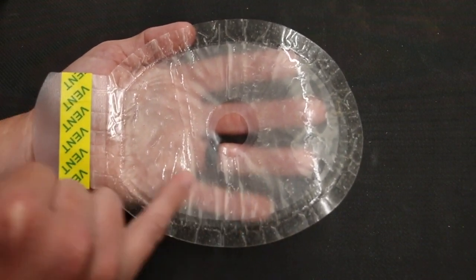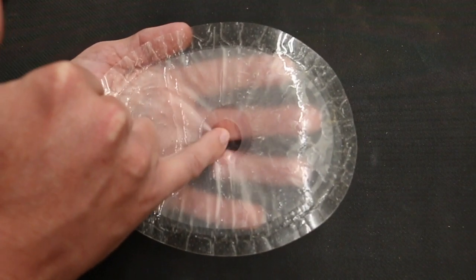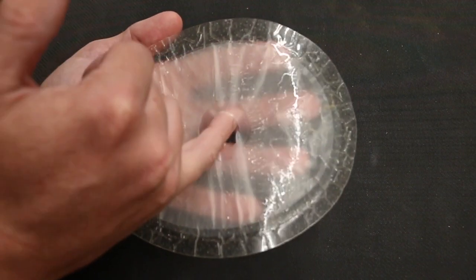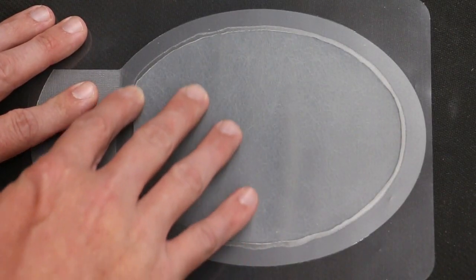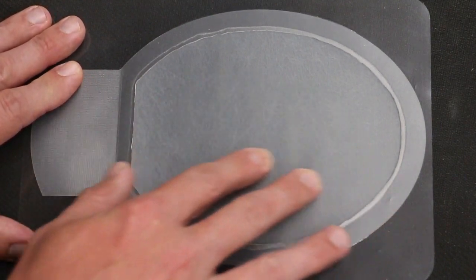So we'll take a little bit closer look at the underside of the chest seal here. So we have the super sticky side here, and then right here in the center you can see it's not sticky. So this is where air is going to travel up in and go towards our vents. It's going to go down either side here. Blood can also go down through here as well. In the packaging, you also get a non-vented chest seal, so no vents here. This is just a super sticky pad that you're going to place on the hole.